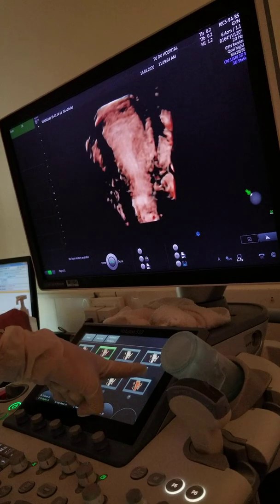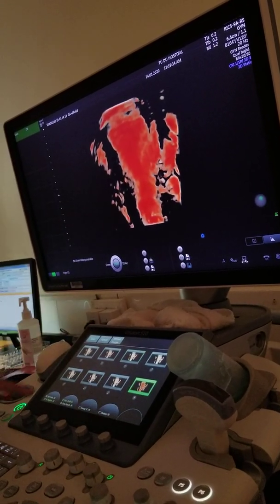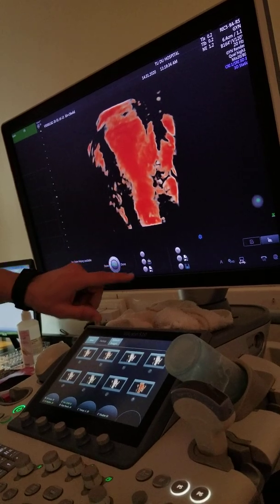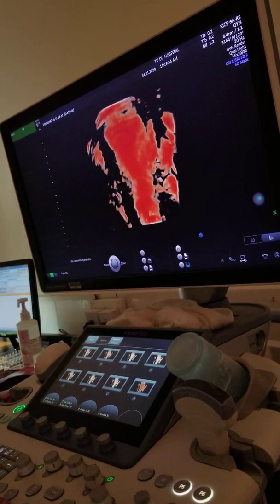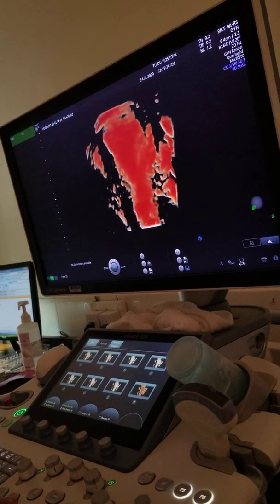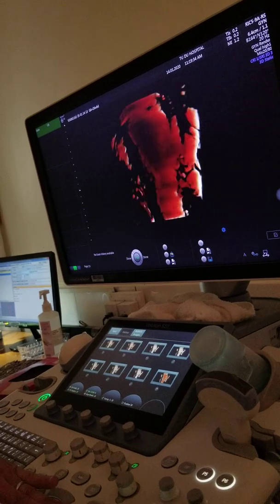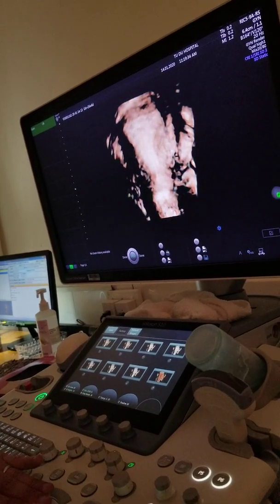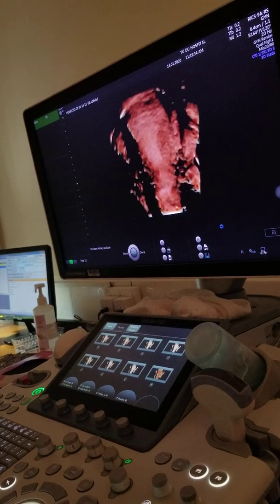Depending on which direction, the position of the light. And you can change the light. So you can put the back. And you see here where is the edit lights? Here, you see? So when you move this, it shows you where the light is. I come from here. No, then I come from here. Then I come from the back. I see. Okay.